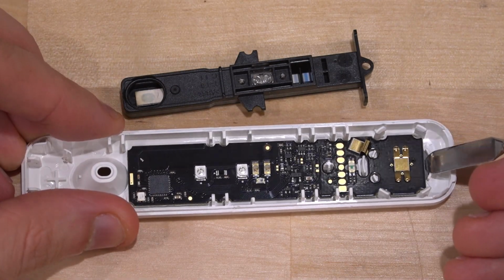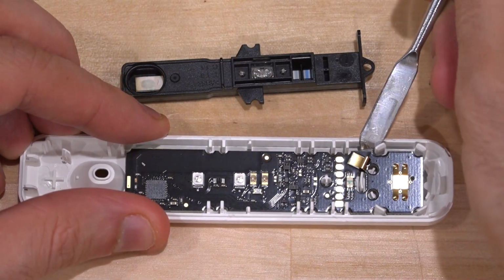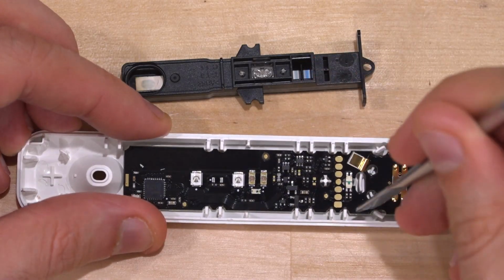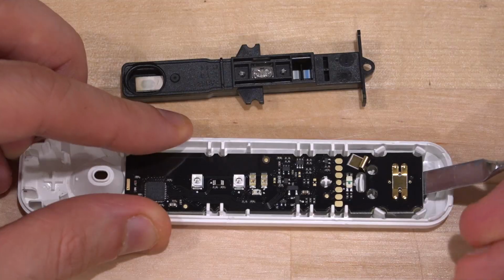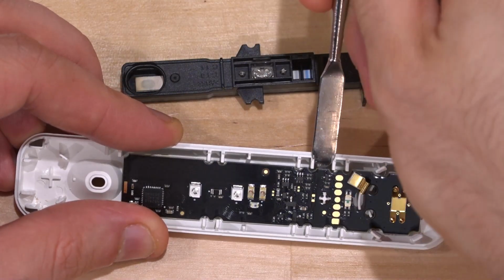Now, I imagine that the way this is designed is probably to ensure that you can only use it once. So there must be some EEPROM in there where the result is written. And then once it's written, it's registered as used. And I'm sure there's some database in the cloud that keeps track of the different serial numbers so that no test can be used twice. So I don't think connecting it to the phone really makes much more sense.